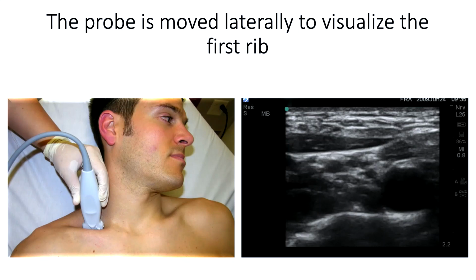Notice that ultrasound is so good to see things that sometimes we're not able to see with the naked eye. But more frequently, ultrasound fails to see what you will see very clearly with the naked eye. Let me explain. Each nerve, now we know there are 7 nerves there. Each nerve is composed not only of neural tissue arranged into fascicles, but also has connective tissue. That connective tissue is intrinsic to the nerve, and it is more fibrous in the periphery, producing a skin to the nerve, and that is the epineurium.